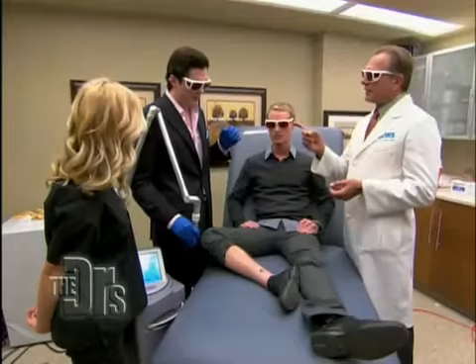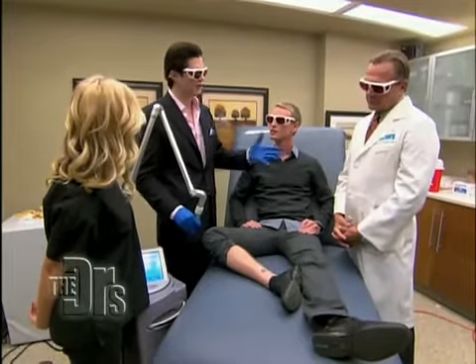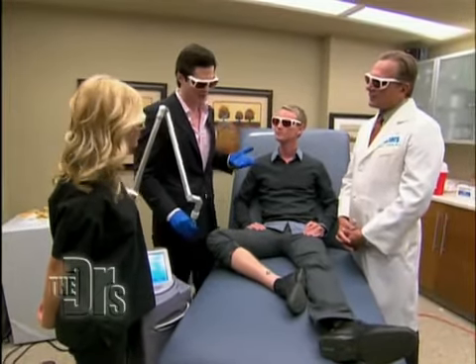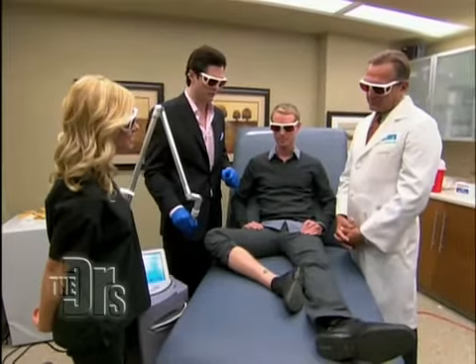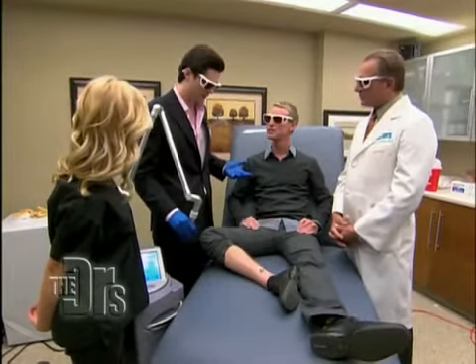It targets the color, the pigment, in the skin itself. Absolutely. It's a process called selective photothermolysis. I know you're thinking nerd alert. You're probably right. I'm a little nerdy, but it goes in and destroys a specific chromophore. And I'm really pleased with the result he's getting. How are you doing? How many treatments does this take typically?